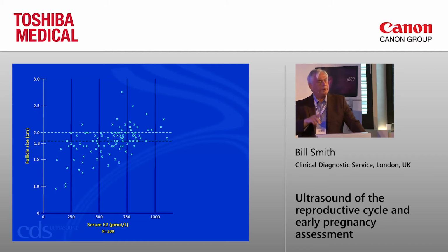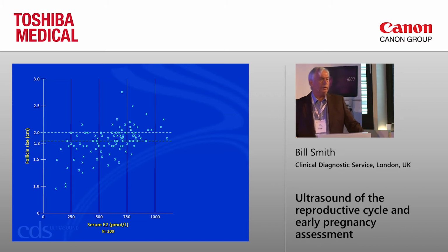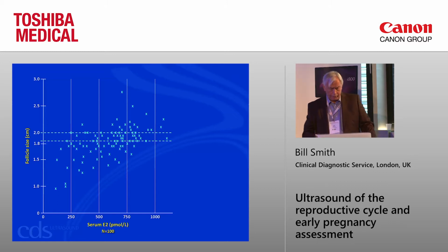Now, it particularly applies to assisted conception, IVF in particular. IVF underuses ultrasound. And if you have 10 follicles with an estradiol level of 1,500, 2,000, you don't know whether that 2,000 is spread across the 10 follicles. You don't know whether just 1 or 2 of those follicles are producing that level of hormone. So therefore, we need something extra in terms of gauging follicle activity.